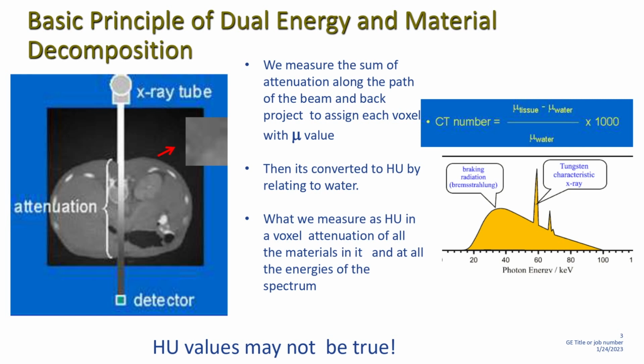Simple question. At high kV, will the attenuation be low or high? At high kV, will the attenuation be low, or will the attenuation be high?